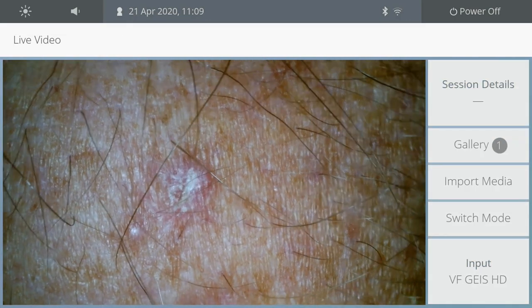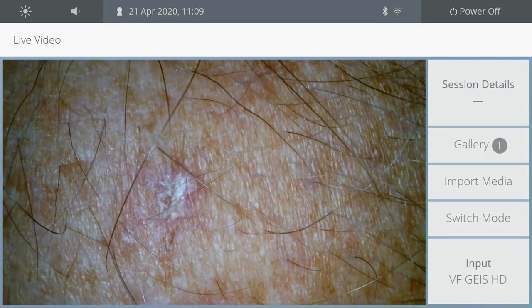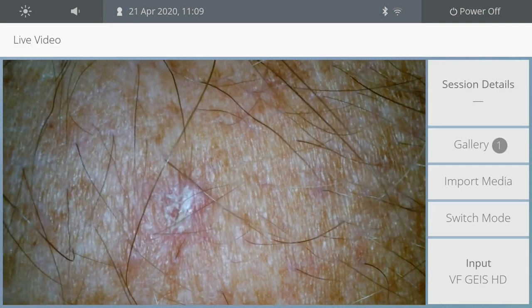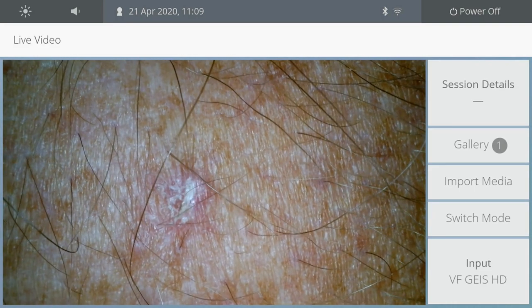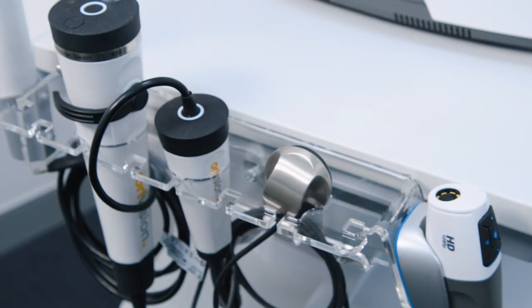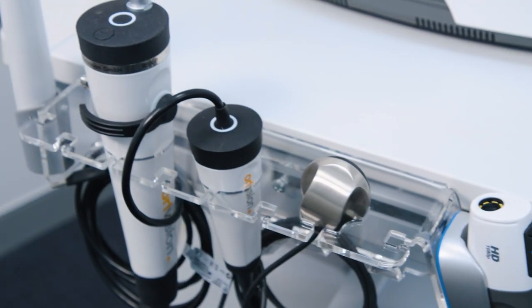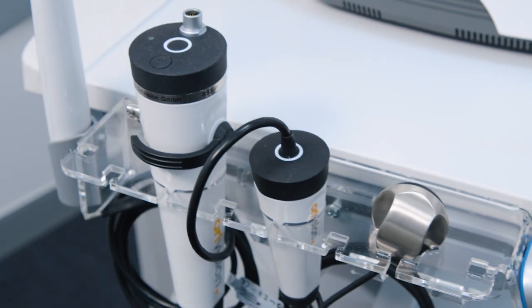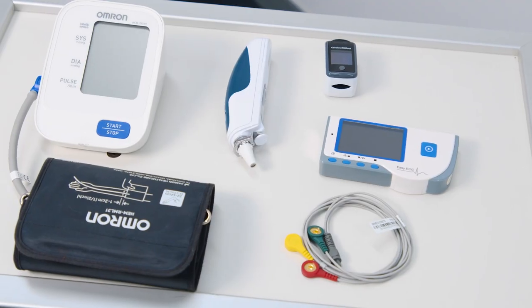Once the exam mode is selected, connected devices will appear in the list and will be ready to use. The exam mode can be used to view all connected peripheral devices.